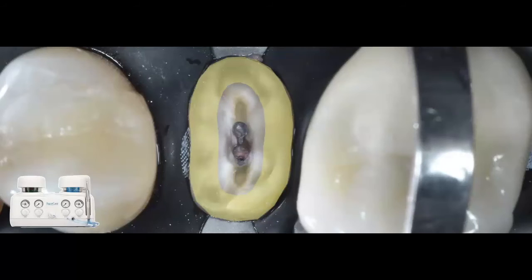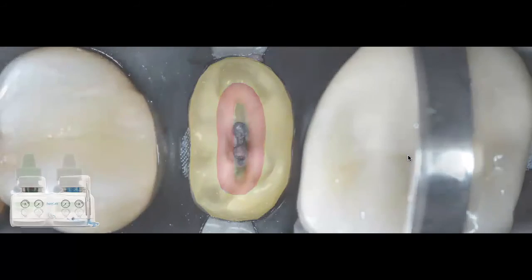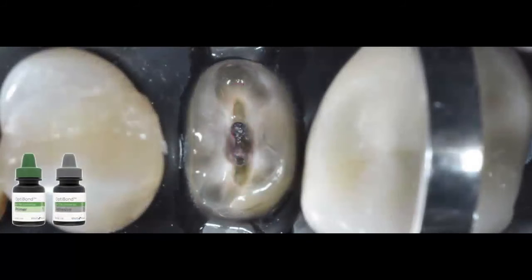And in this particular case, because it's an endo-treated tooth, you don't want to have any decay left behind. You want to have everything nice and clean. But there are more collagen fibers in this area right here where the red mark is, because that's the pulp chamber. That's the type of dentin that you're going to have there. It's very deep dentin, so you're not going to have a lot of hydroxyapatite on these collagen fibers, or mainly on the peritubular dentin. Obviously you're going to have less bond strength.